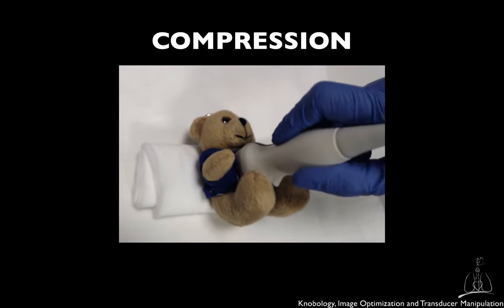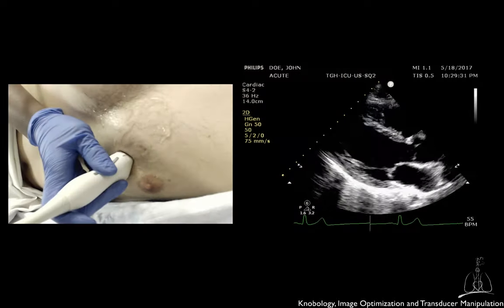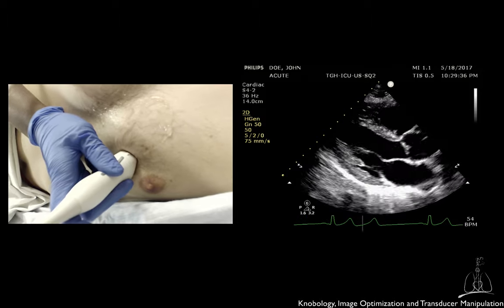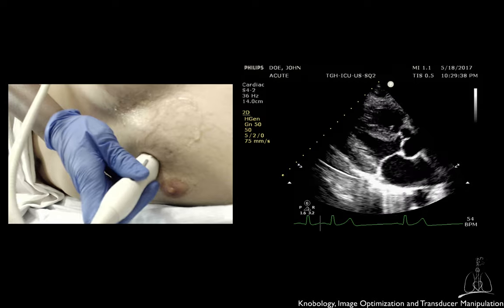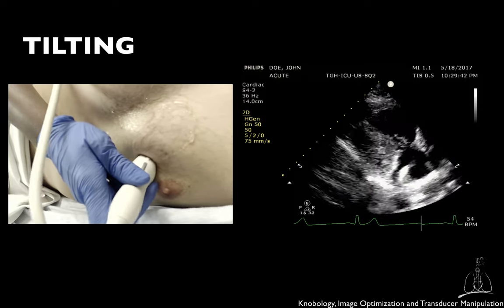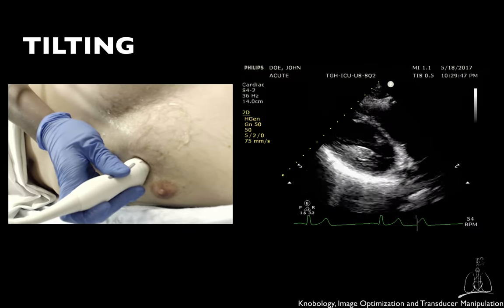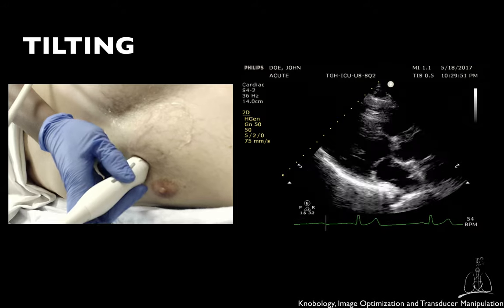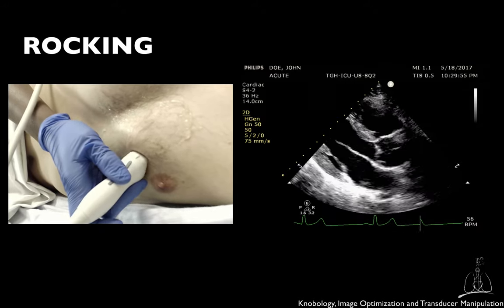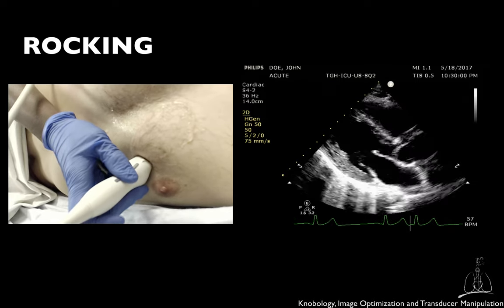Always remember to minimize as much as possible the compression to maintain the patient's comfort. For example, in this parasternal long axis view, the marker is directed toward the patient's right shoulder. A tilting movement allows visualization of different planes in the same long axis of the heart without sliding the transducer. Rocking changes the field of view of the same plane or centers the area of interest, for example the aortic or mitral valve, without sliding the transducer.